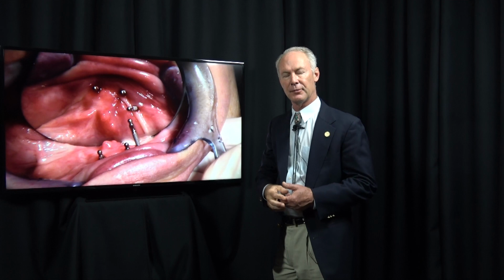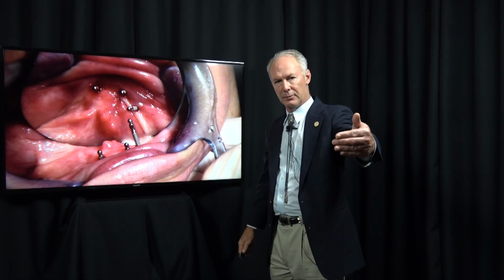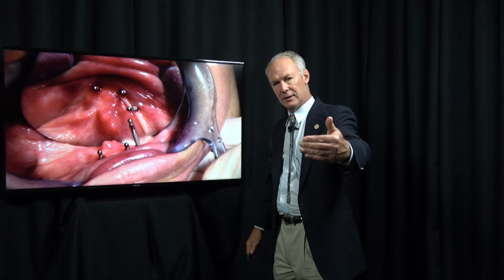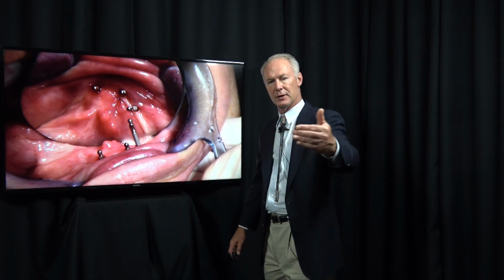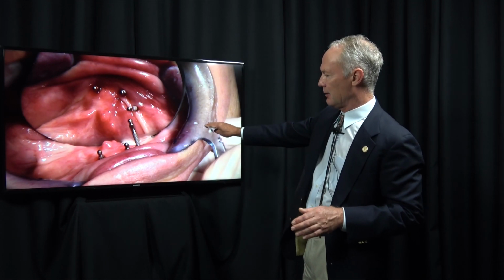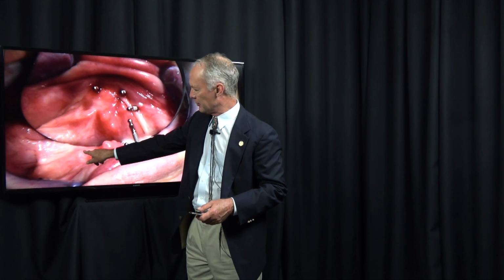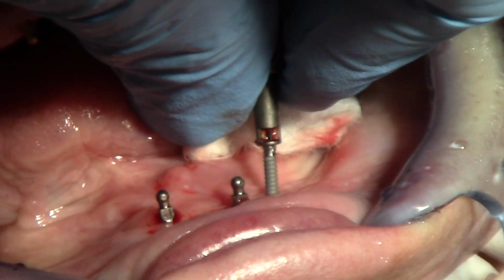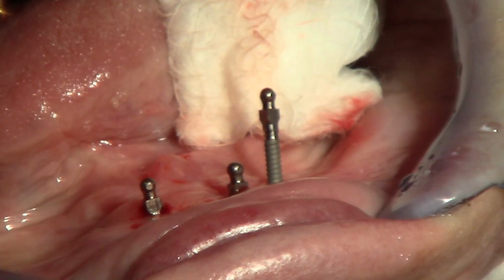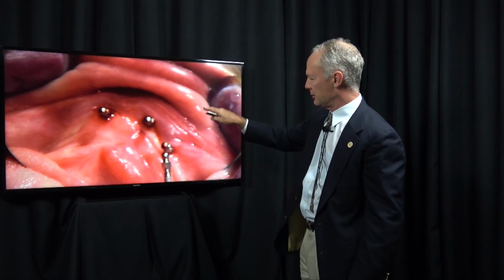So it's very important that you identify the mental foramen before you drill your pilot hole distally. You want to be sure you're at least 7 millimeters mesial to the mental nerve. And be especially careful in these flat ridges, because it could have migrated up here to the top of the ridge, and the mental nerve is actually on top of the mandibular bone. Now I'm going to constantly check my angulation with a large mirror to be sure that they're generally parallel.